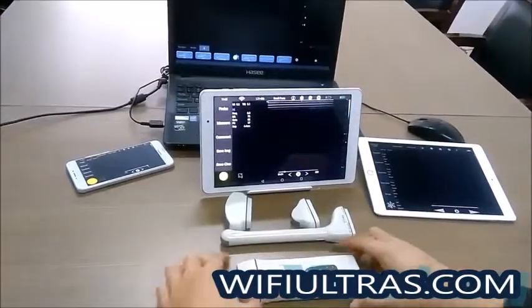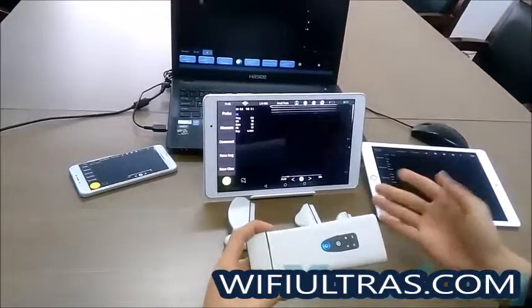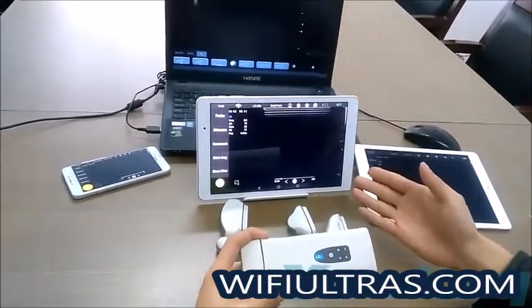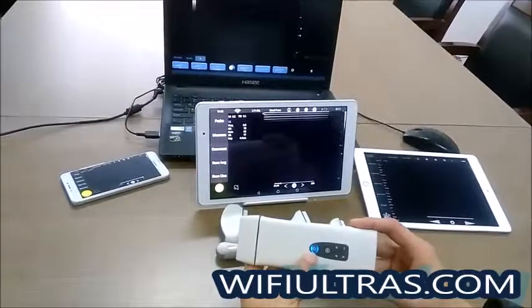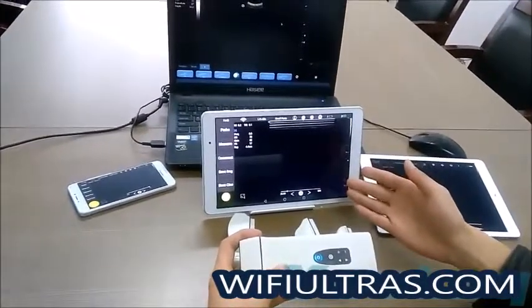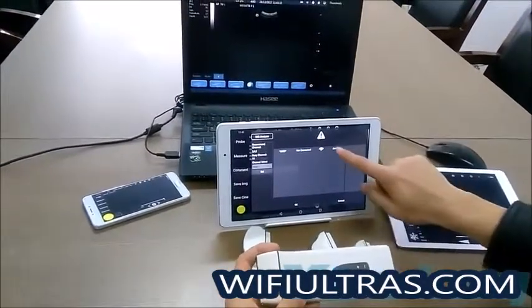Now I'll show you how to connect this wireless ultrasound with the terminal device. This is an example using an Android tablet. You need to long-press the power button to turn the machine on, then run the software on the Android device, enter this function, and then connect it.